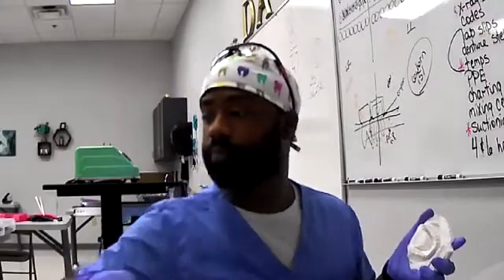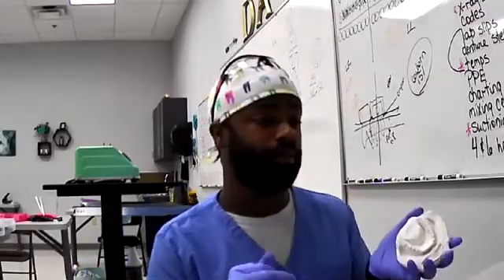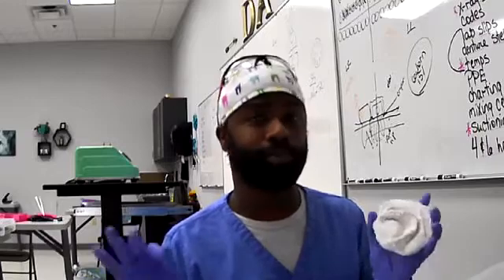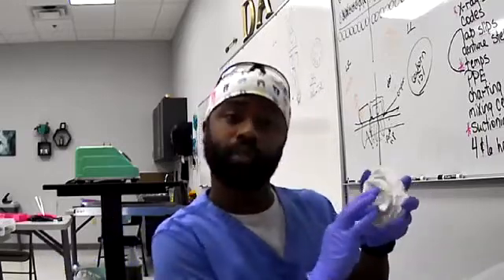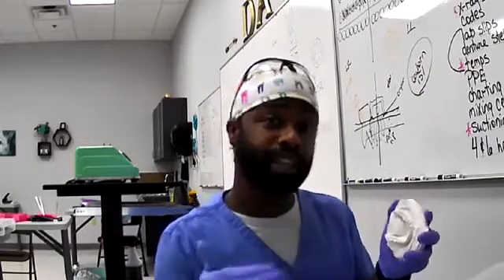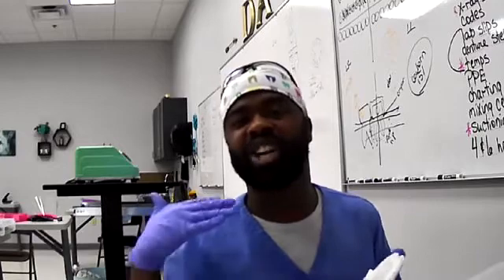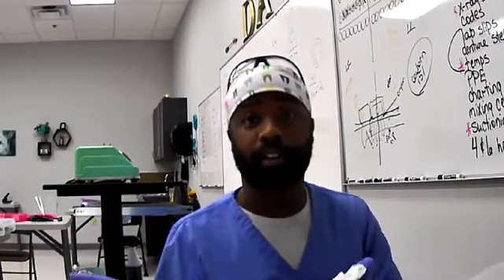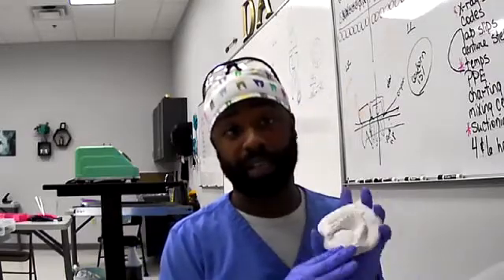Once everything is exactly how they want it, most of the time they'll take a wet Q-tip or a wet cotton ball, wet cotton roll, something with just a little water, just a little damp, and they'll rub it on the tooth just to make sure everything's cleaned off real good. That way, when the patient leaves, they don't have a chalky taste, they don't have flakes coming out, or if the flake is already in the mouth, you go ahead and rinse everything out real good because you don't want them swallowing any amalgam.